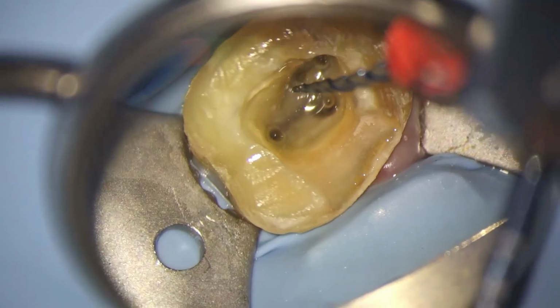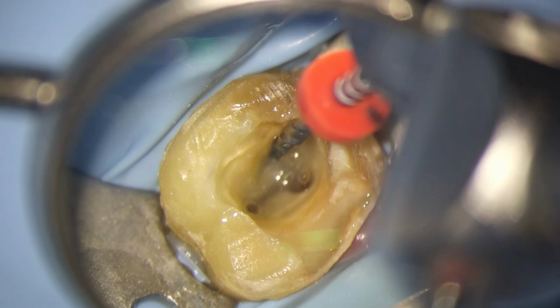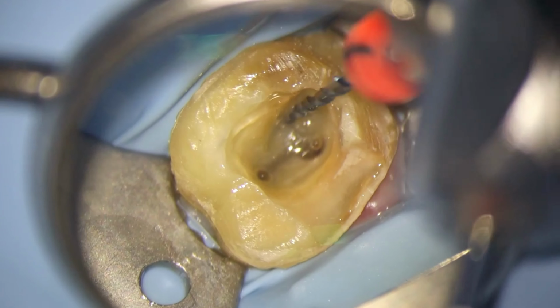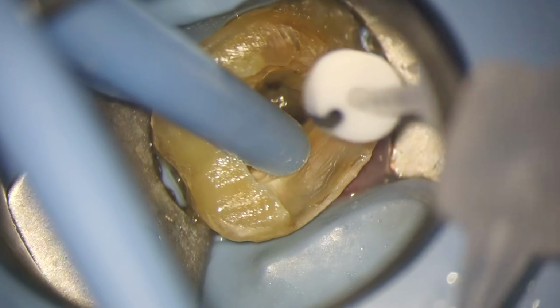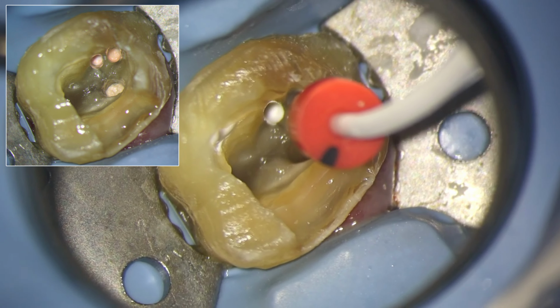Following which we drill into your tooth and try to get access into this black space over here, which is your root canal system. Once we do that, we use motorized equipment to clean the space out really well. And we use a disinfectant, which is essentially bleach, to disinfect the space really well. Following which we fill it up with an appropriate root canal filling material. So you can see these white lines over here. This is essentially root canal filling material all the way down to the tip of your root, which means that we've reached the right length, homogeneous in terms of the condensation as well, and this is a restoration that's been put on top. So all in all, I'm quite happy with how that treatment looks.